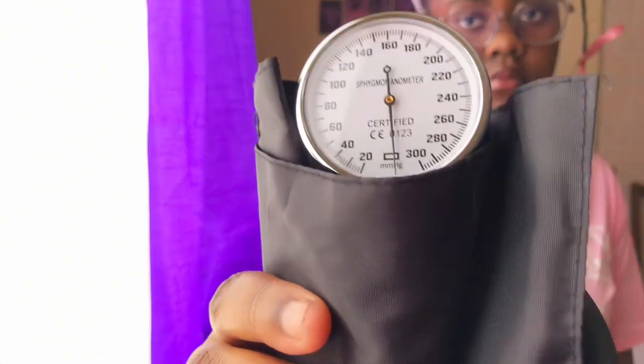The next item is the blood pressure machine — self-explanatory, it is used to measure blood pressure. I'm showing it this way because if I unwrap it, it will be difficult to put it back in the bag. As you can see, you have the inflatable cuff, the mercury meter gauge or aneroid meter gauge — they call it different names — and you also have the bulb used to inflate and deflate the cuff.